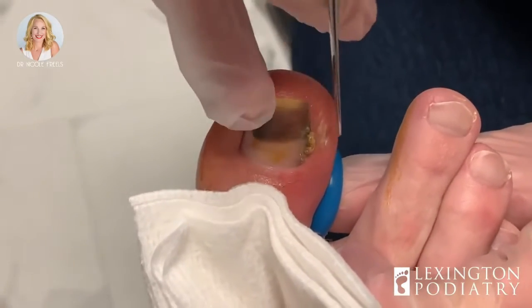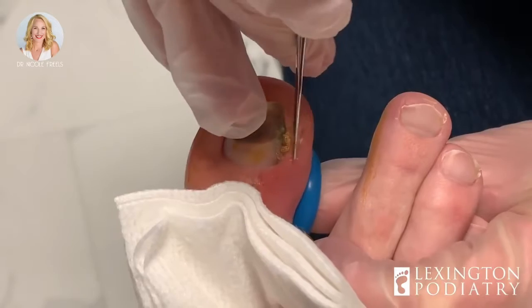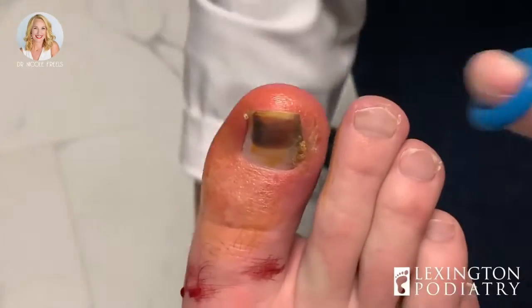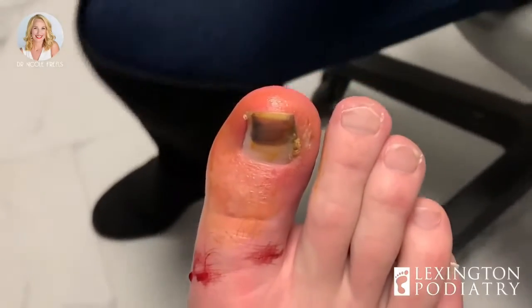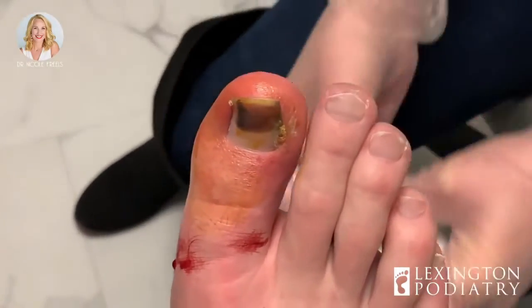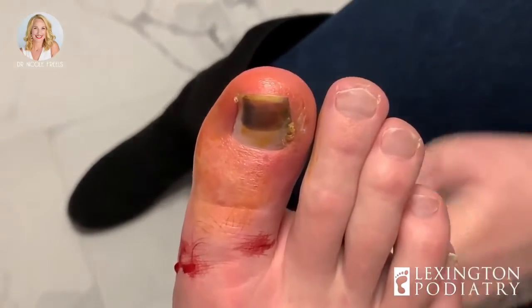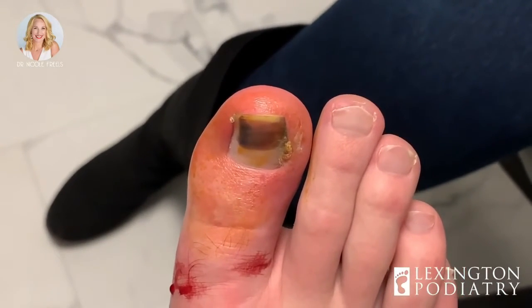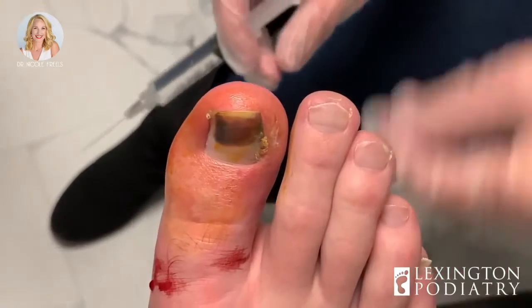Little down bottom there. Here? On down. Closer to you? Yeah. Here? Yeah. Okay, let's put a little more anesthetic in. Just a little more. You probably won't feel much of this. I'm taking an alcohol swab too. I need that. We've got to get the bubble out, the air out. Thank you.